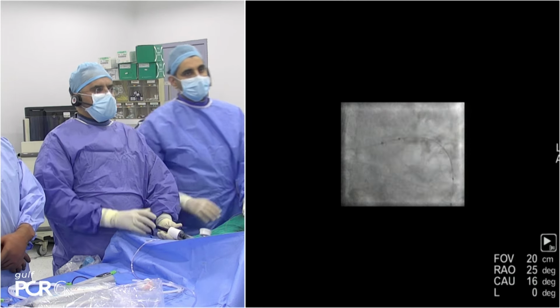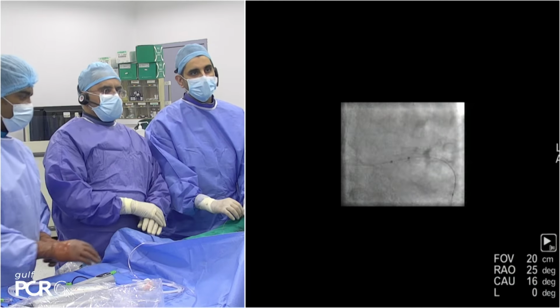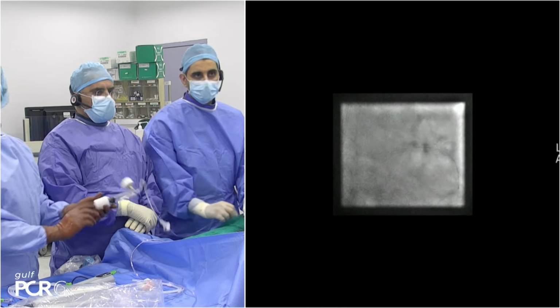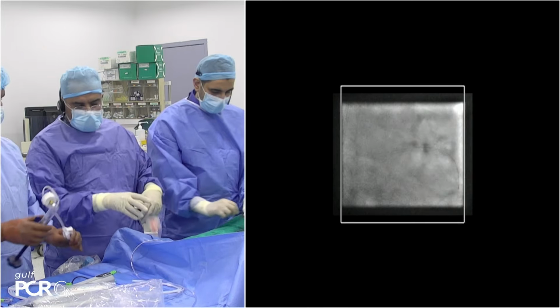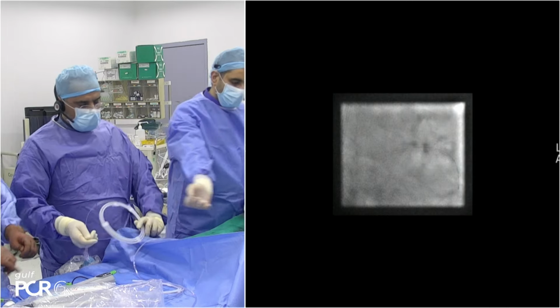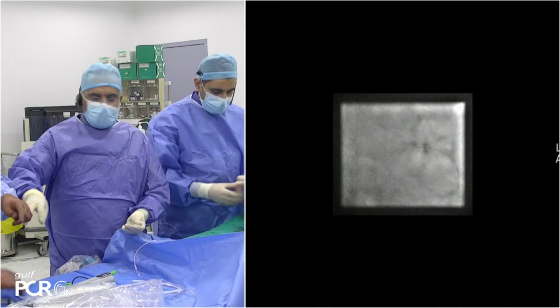Okay, so we're going to do stent viz in this view as well. Clearly, you can see it open here. I don't know if you can see our stent viz there? Not very clear. They cannot. Okay, well, you have to trust us. On our screen we can see that it's open in both projections with the stent viz as well. Could you ask the guys to show it? Actually, they couldn't. We tried. Now they're telling us they can't.